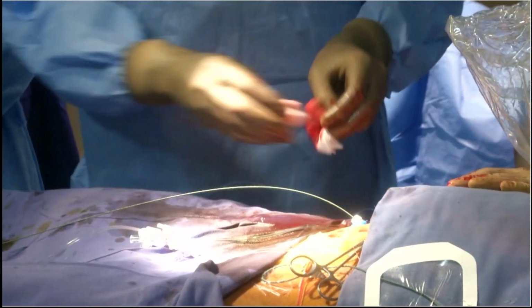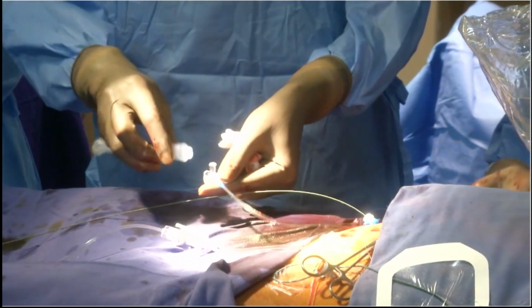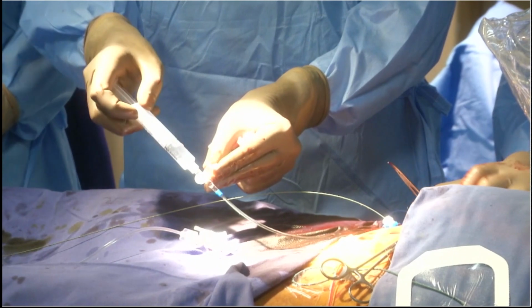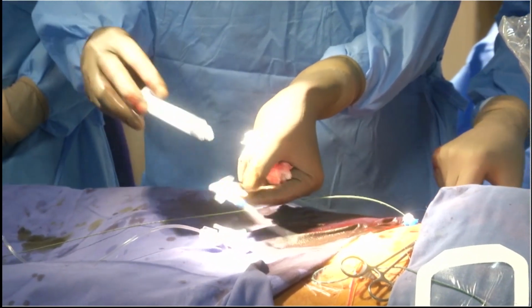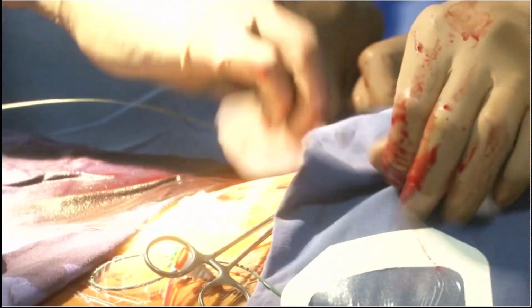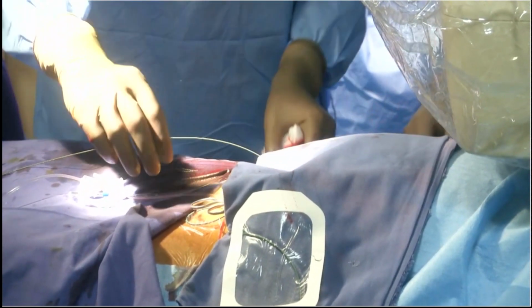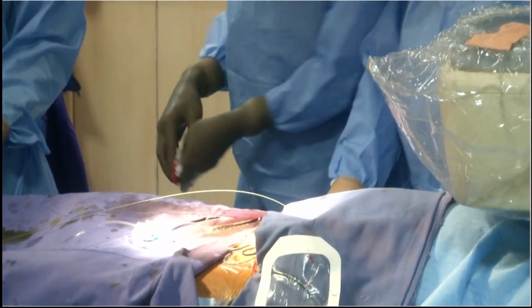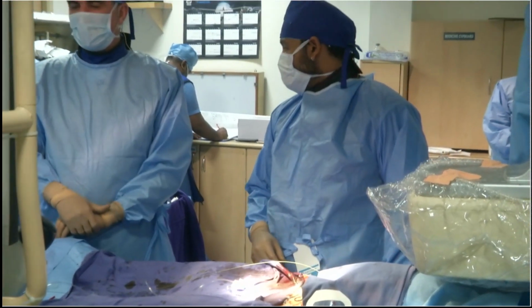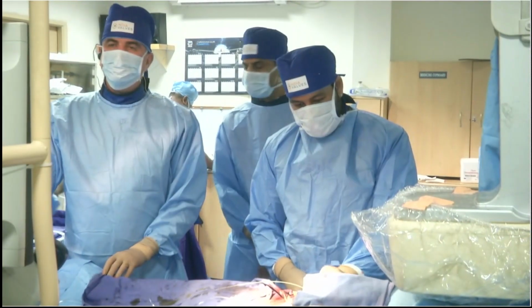Maybe you have no patients with 9 millimeters. Yes, it's really rare to have a patient with a 9 millimeter vessel, but 1 ProGlide is usually sufficient, and sometimes we may need a second one, and the provisional additional Angio-Seal also works very well. I prefer using 2 mechanisms, suture-mediated and plug, for better hemostasis. We also don't hesitate to do contralateral ballooning in case of poor control of hemostasis.